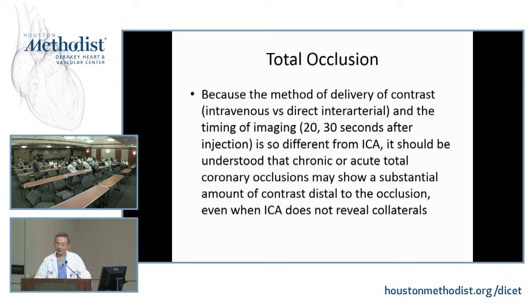If you're injecting directly into the aorta, a power injection, the same amount of contrast, you can barely see any coronary. We're giving the same amount of contrast from the vein, and we can see the coronary tree, not perfectly, but reasonably well. So that's why coronary CTA is so powerful. That's probably the major advantage of CT because of the technology. CTA is different from fluoroscopy.